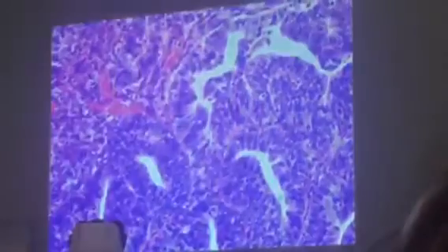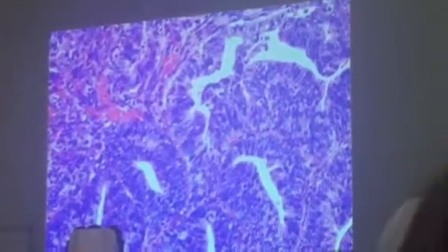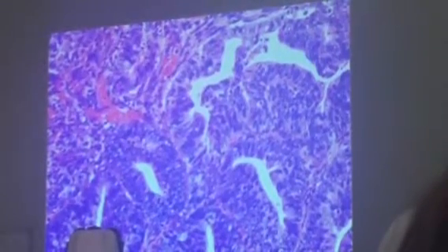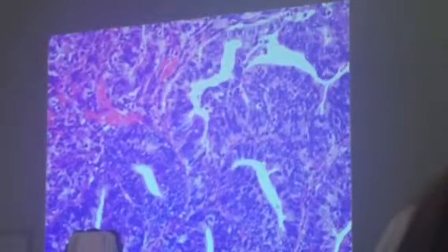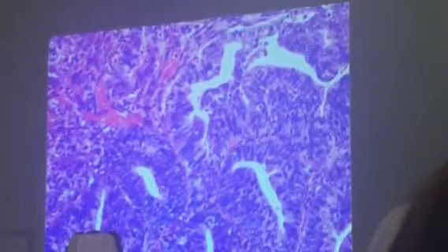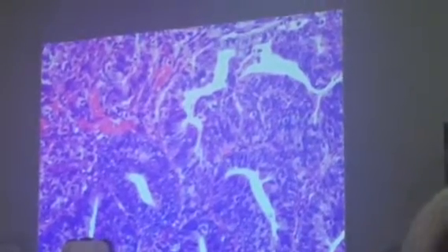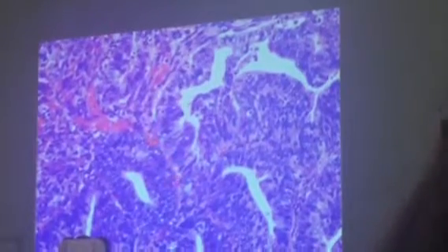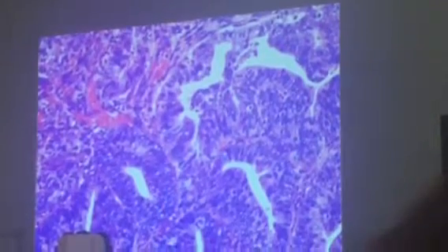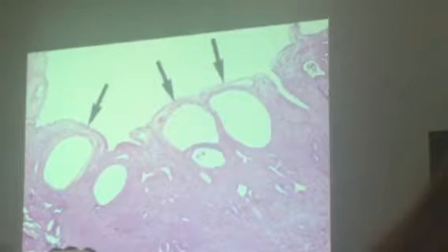On top of each other. So that's also a sign of endometrial adenocarcinoma. And of course, yung sinasabing cribriform structure, which is glands within glands. Okay? Unfortunately, I don't have a picture of that. Pero suffice it to say, basta na wala na yung stroma, yun na yun, adenocarcinoma na siya. Yung complex hyperplasia, dapat may stroma.